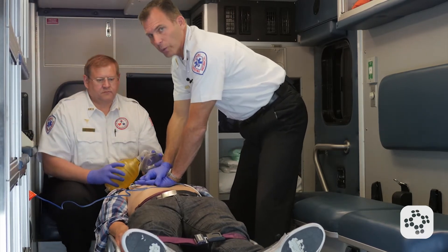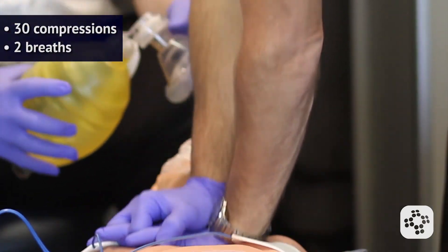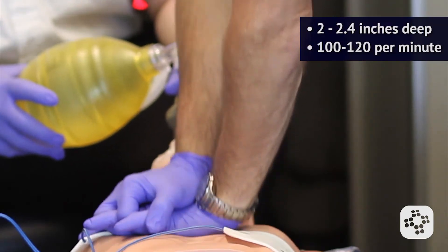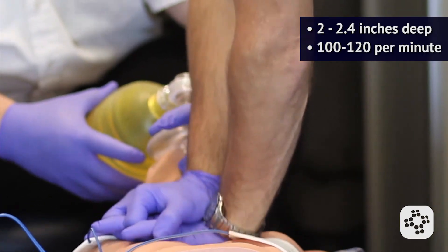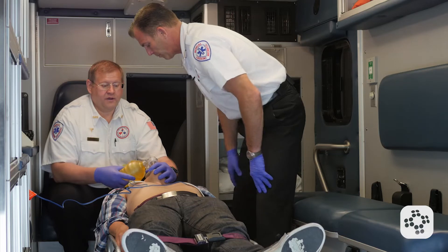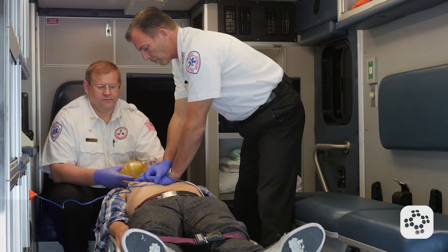Now we're going to do five cycles and we're going to incorporate the two rescue breaths after 30 compressions. Continuing compressions through the count — 10, 11, 12 ... up through 30. Breath. Breath. Good breaths. Then right back into compressions and another set of 30, followed by two more breaths.